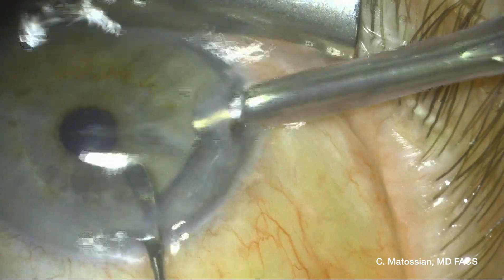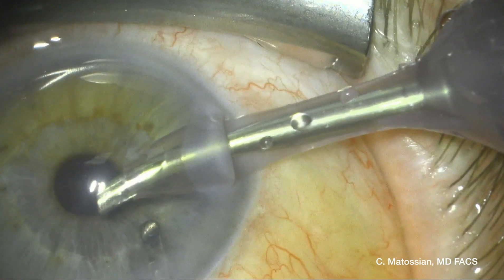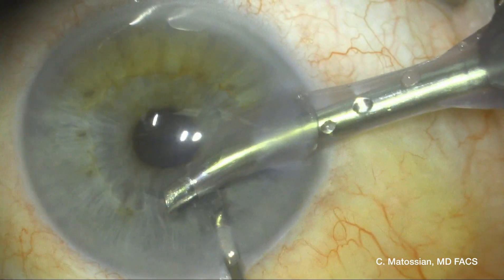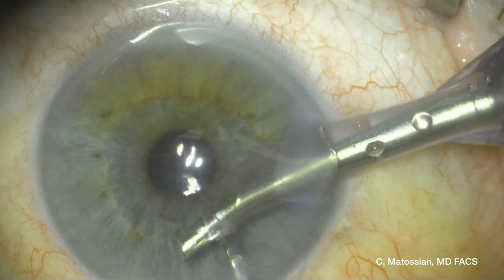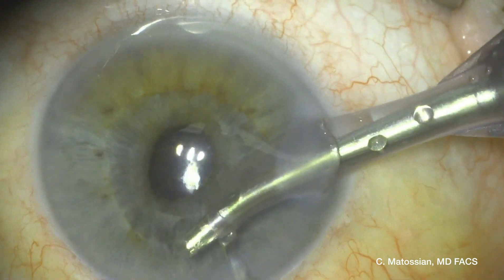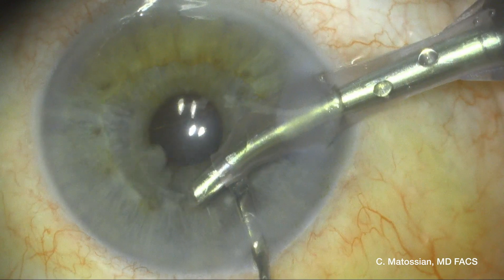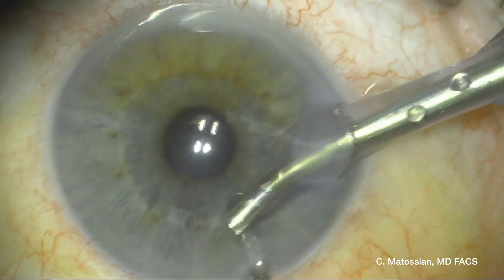With low flow settings, I'm coming in with my phaco handpiece, and immediately over the nuclear fragment, which I have stabilized with my cotch manipulator through the side port, I'm able to phacoemulsify the fragment. As you can see, I'm grabbing it right now — it's coming into the port — and gradually removing it without any complications.